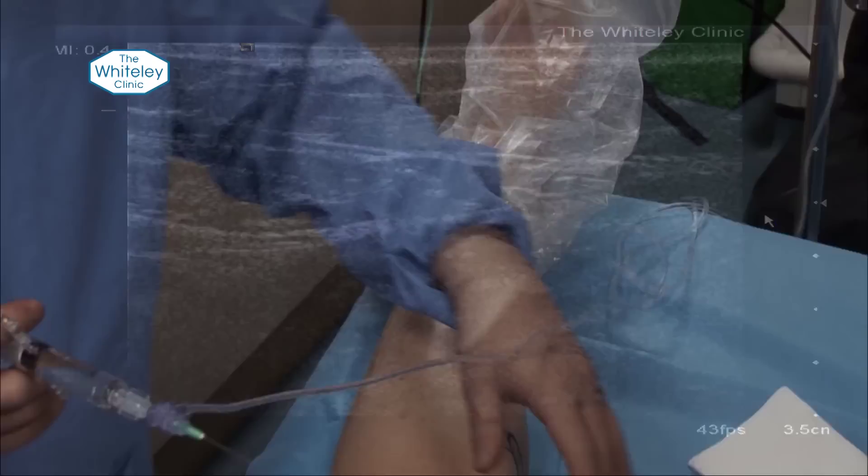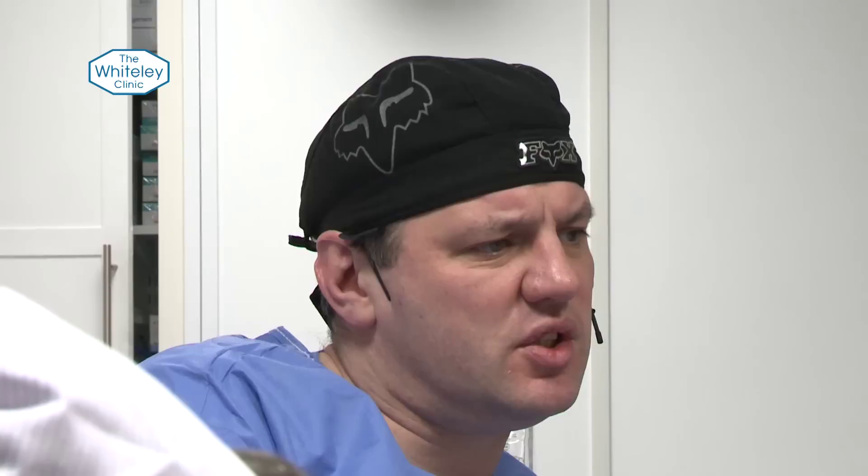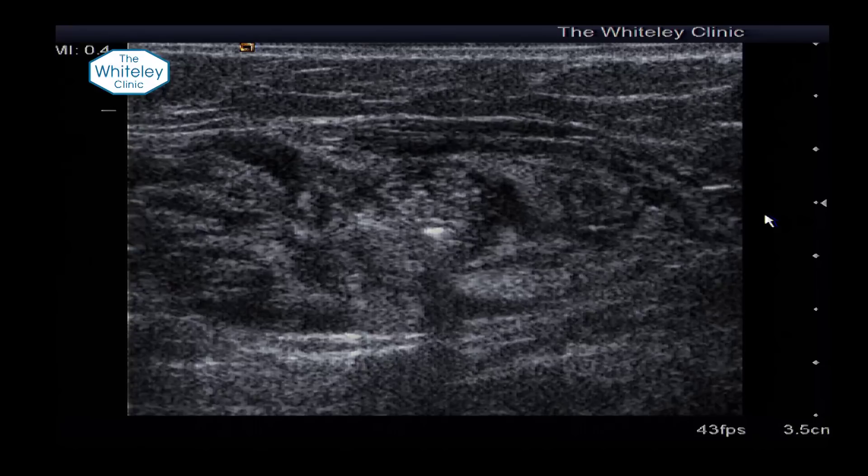There we can see just right next to the vein, which is highlighted by the RFITT. The little bit of white that's gone in there is a little bit of air — you always get that in the first couple of pumps, just a few bubbles, but it always looks impressive on ultrasound. And you can see what's called the 'eye of Horus' as the eye opens — between the two fascial planes we're actually putting all the local anaesthetic as tumescence.